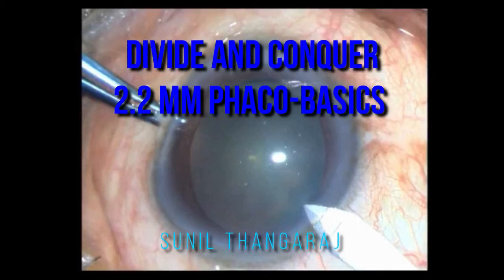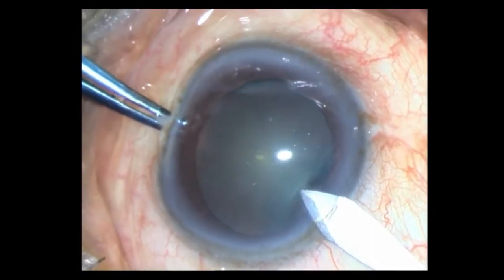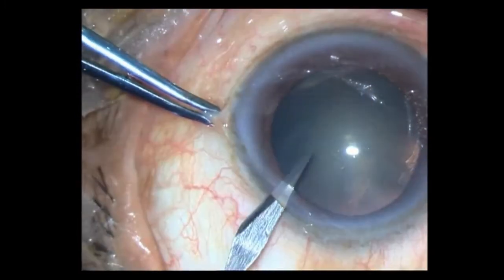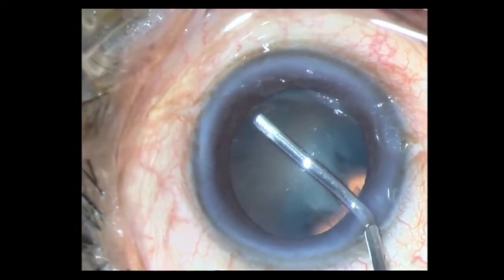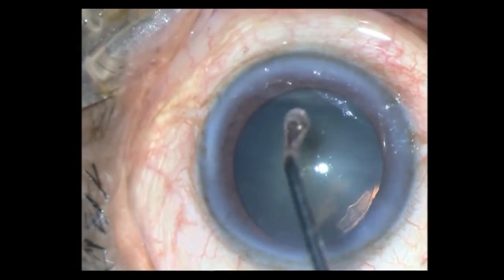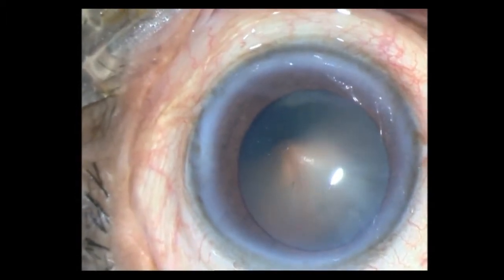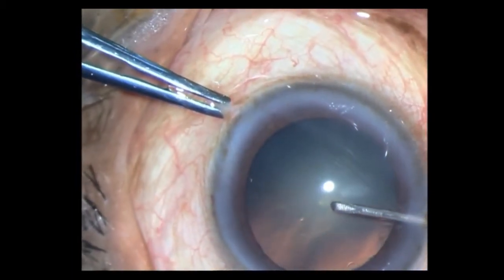This is a routine soft cataract, about grade 1 to 2 nucleus sclerosis, where I will be demonstrating the divide and conquer technique. I have done my incisions, put in some HPMC, and go ahead after putting some HPMC over the cornea to perform the capsulorrhexis with my bent 26-gauge needle.